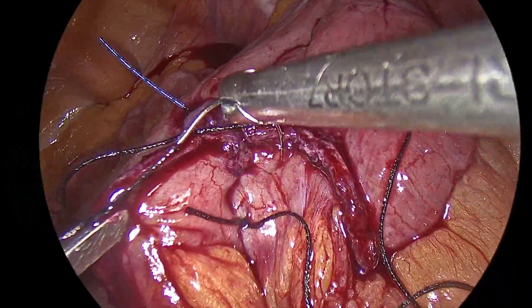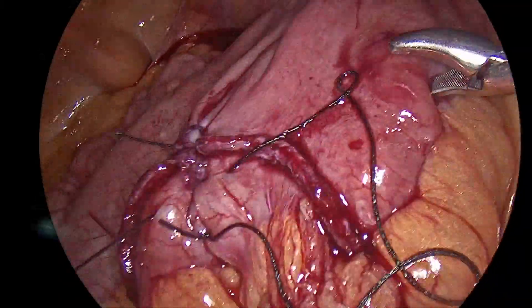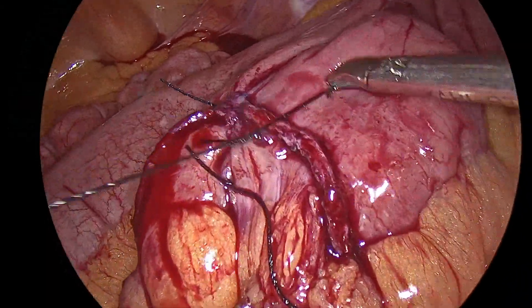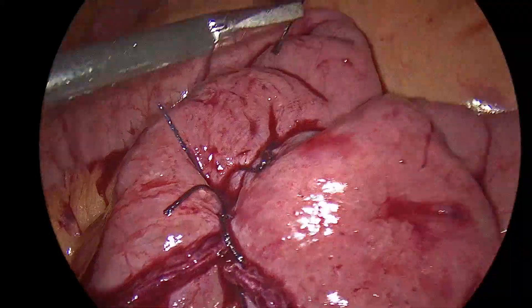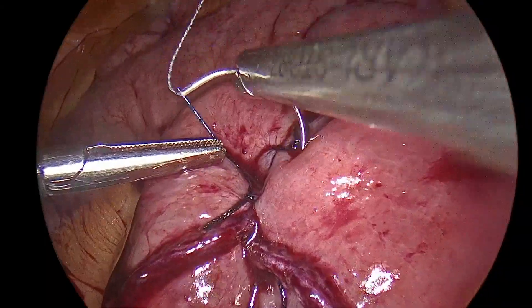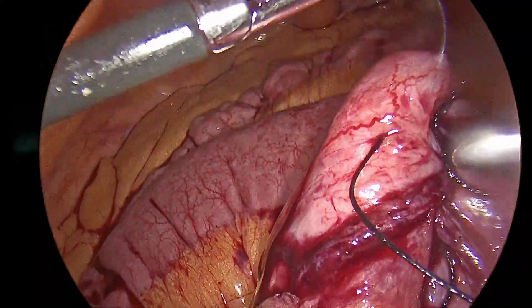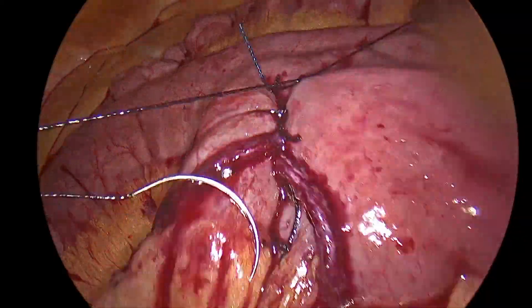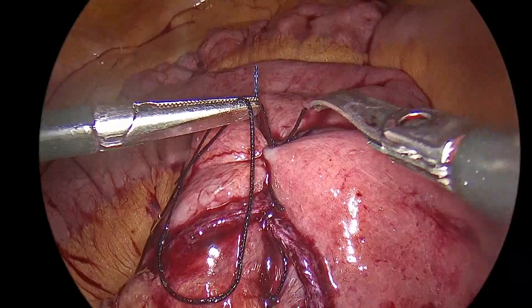Finally, we close the mesentery, then check for any leak. The specimen is inserted into an endobag and extracted through the 12 mm port used for firing the stapler. We irrigate the cavity and place a flat drain close to the anastomosis. We then desufflate and close the ports using a port-closure needle for the 12 mm and 10 mm ports to prevent a port-site hernia in the future. This completes the surgery.